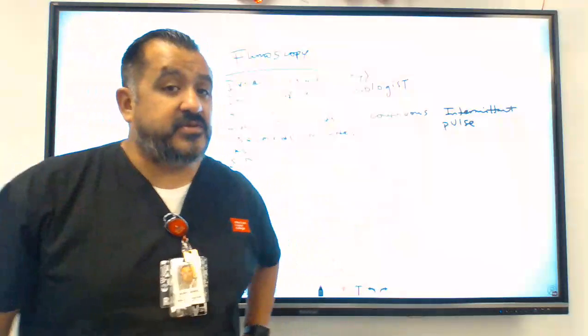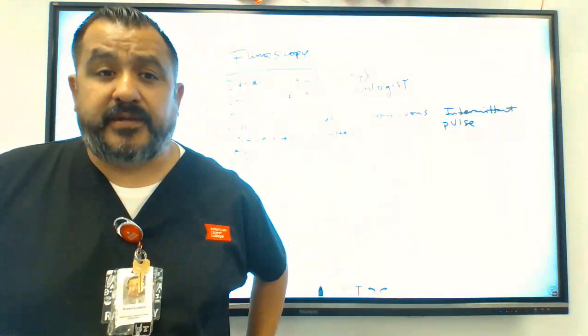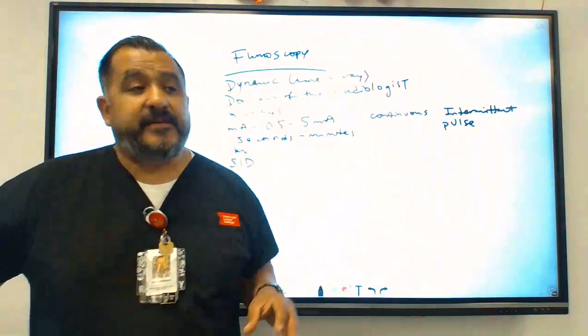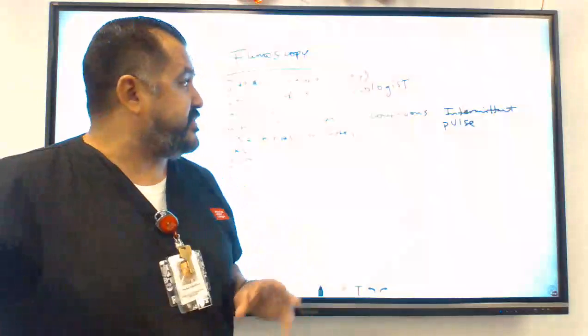Which one do you think is going to have the most dose for the patient? Between continuous and intermittent, what do you think? It's going to be continuous, right? Because you're getting more radiation going through the patient versus blasts and pulses of X-rays.